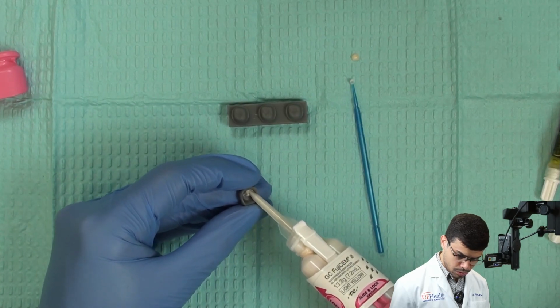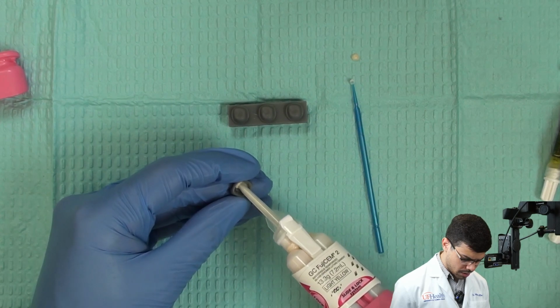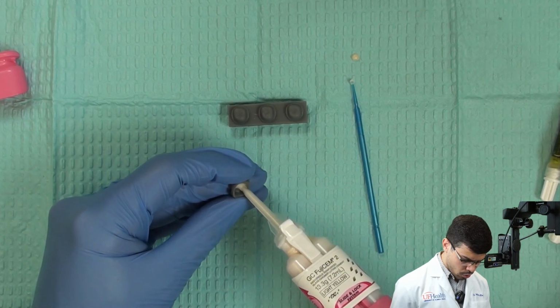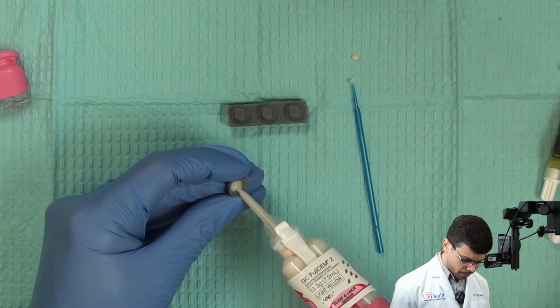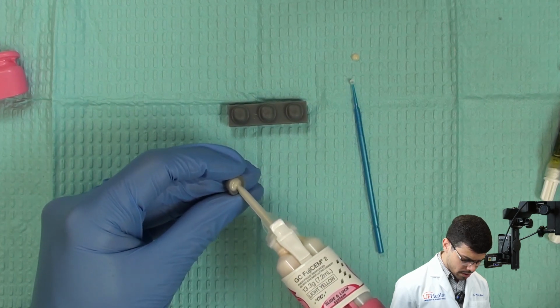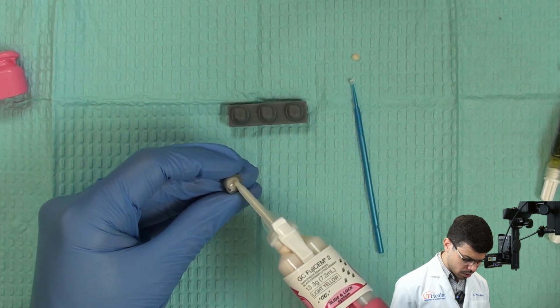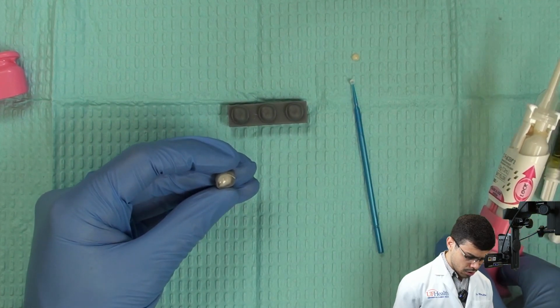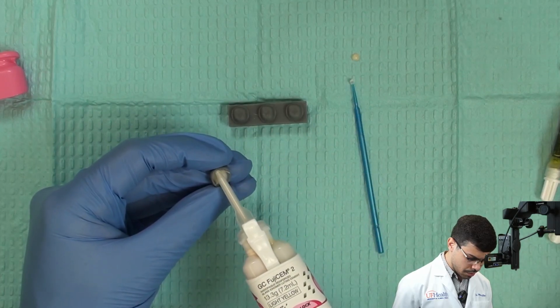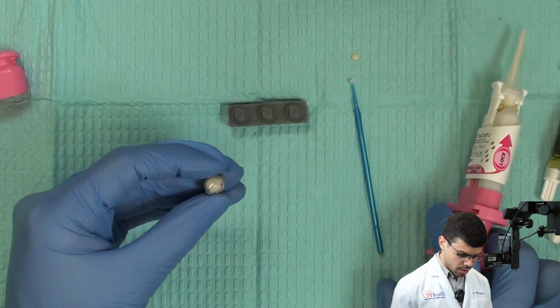So you have to start on the margins here of the crown. Make sure to have the tip all the time in contact with the crown, okay? If you don't touch the crown, you're gonna have voids inside, okay? So you just need to fill probably 1/3 to half of the crown. You don't need more than that. Too much cement is too bad. And make sure to have a little bit on the sides here, okay? On the margins. Very nice.